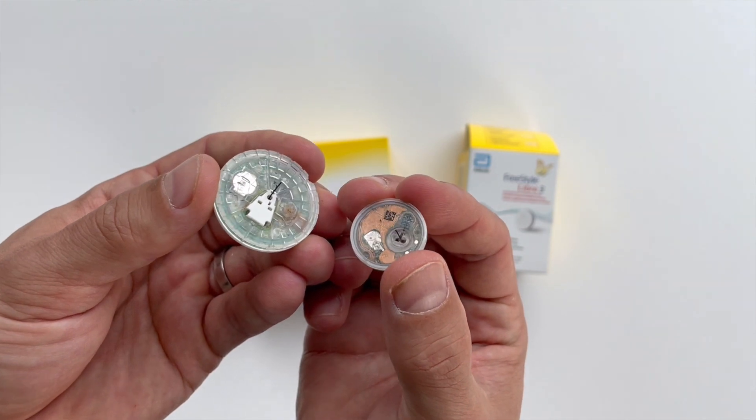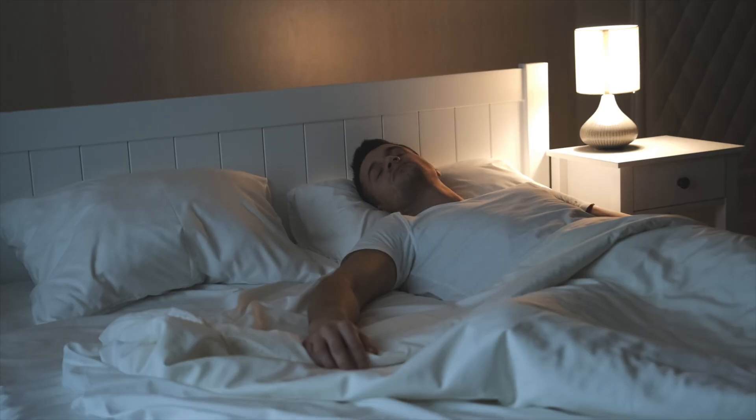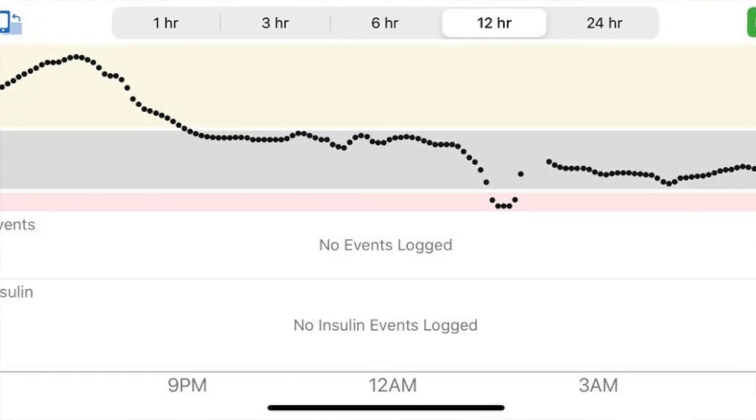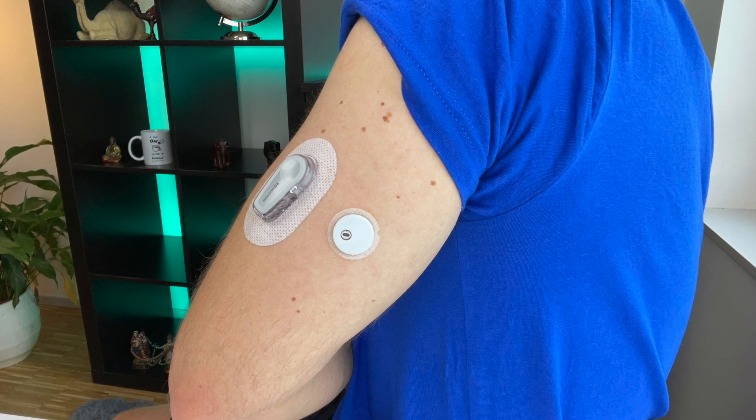And I'm not saying it's not possible to pull out Libre 3 by accident — it definitely is, especially because of its small contact area. Another thing to consider is comfort when you sleep. The bulkier shape of the G6 will probably bother you a lot more when you lie on it and will give you a lot more compression lows. Both sensors are water resistant so swimming with them and taking a shower is not a problem.